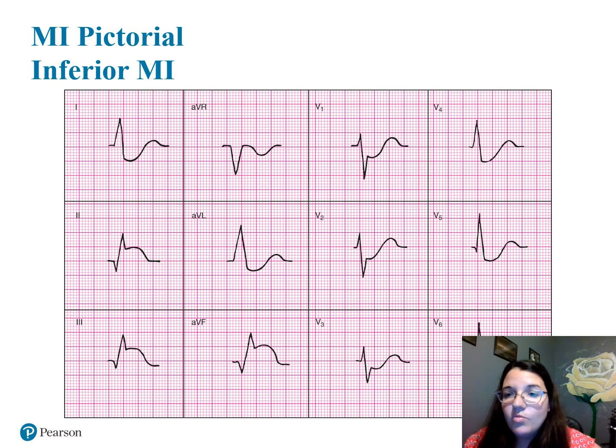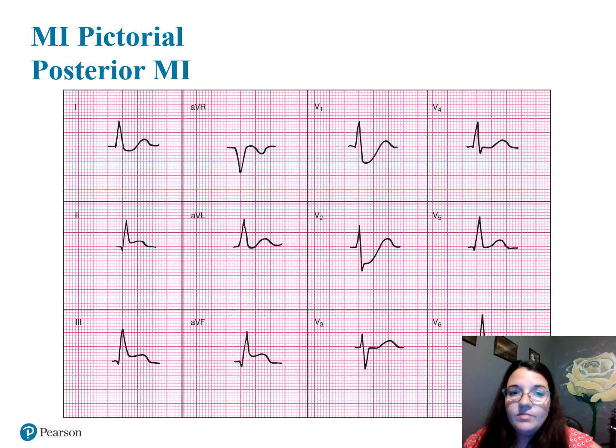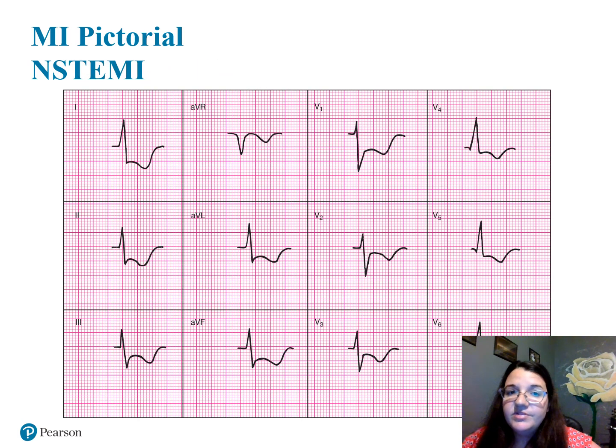That tells me what wall. So here you go and memorize. Here's your lateral, and here's your posterior. Here's your extensive anterior and anteroseptal, your non-STEMI.